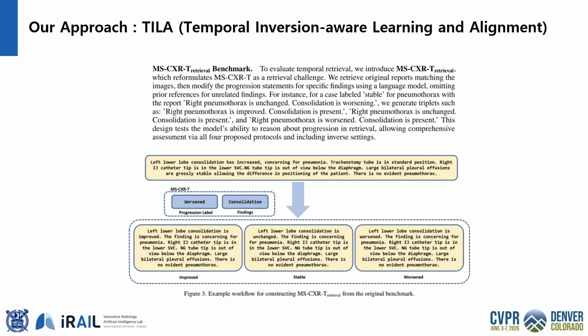We also introduce MS-CXR-T retrieval, a new benchmark that reformulates MS-CXR-T for retrieval. For each pair, we generate three directional variants, improved, unchanged, and worsened, isolating progression as the retrieval target.